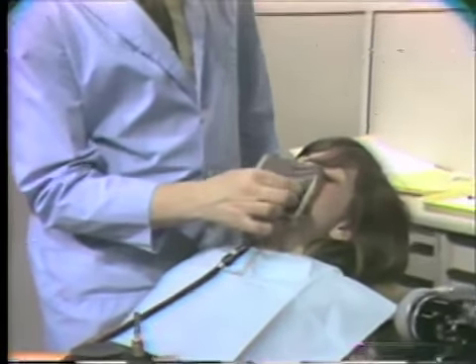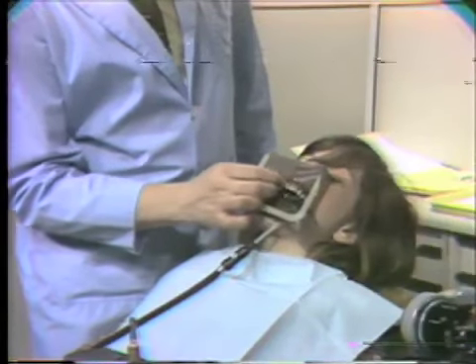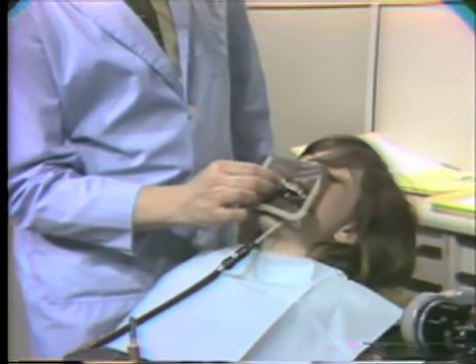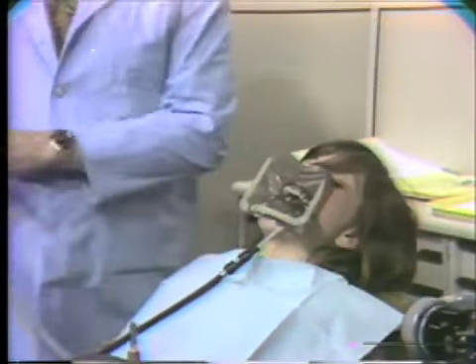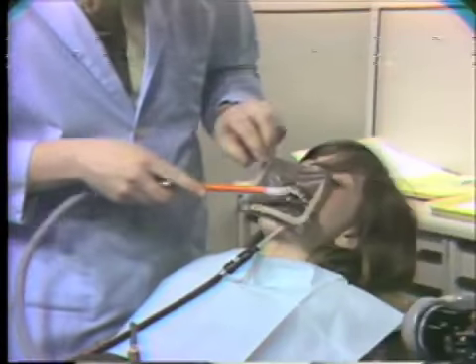Next, we'll wash over the 6 anterior teeth with some cotton moistened in alcohol. The purpose of this is to remove any of the lubricant that remained on the tooth. Again, to allow us to better get at the enamel with the oxidizing agent. Let's just dry up a little bit here.